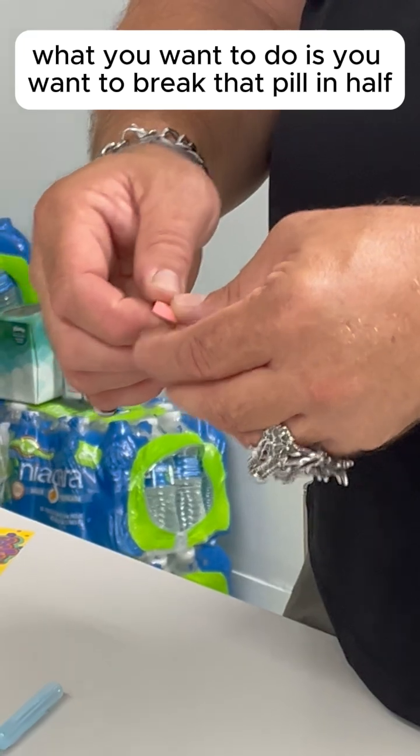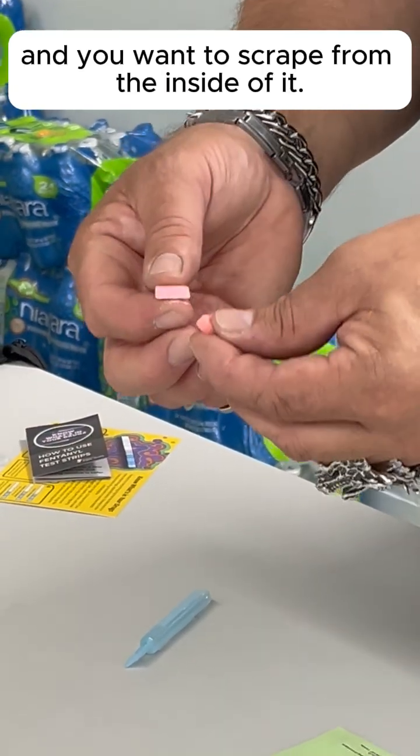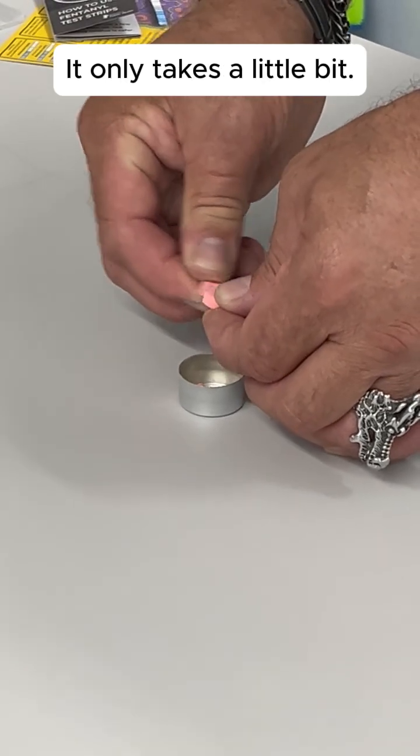So what you want to do is break that pill in half and scrape from the inside of it. You can either rub both halves together or use a knife to scrape that. It only takes a little bit.